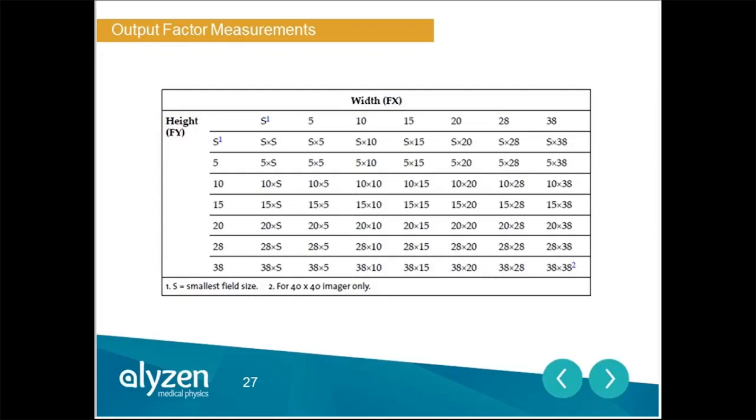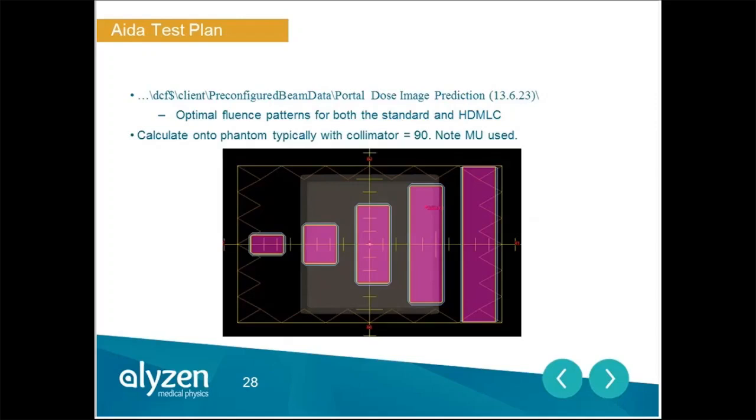I like to get full range of my panel, and I use portal dosimetry oftentimes as another verification of my SRS or SBRT plans, along with a point dose measurement or something like that. This plan I create manually in Eclipse. It's a pretty substantial undertaking, and you should note that delivery of this is going to be probably the biggest chunk of your time, just because you need to deliver this in treatment mode so you can get your images acquired. I then use the output factor tool provided in the portal dosimetry workspace, and you'll see that in a little bit.